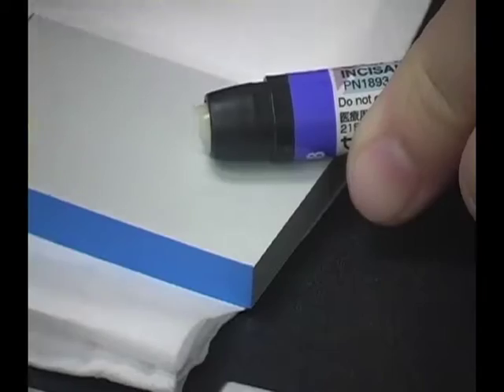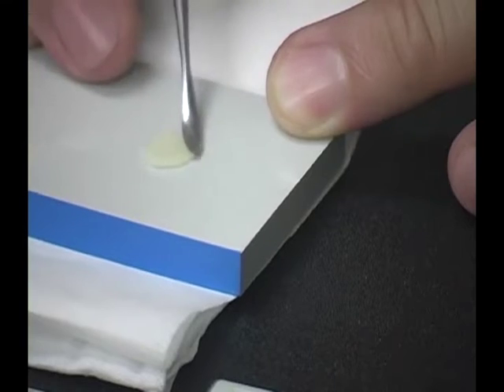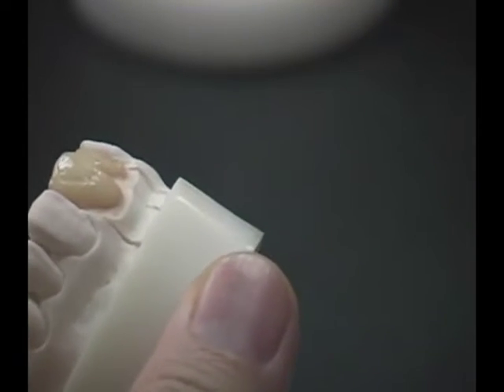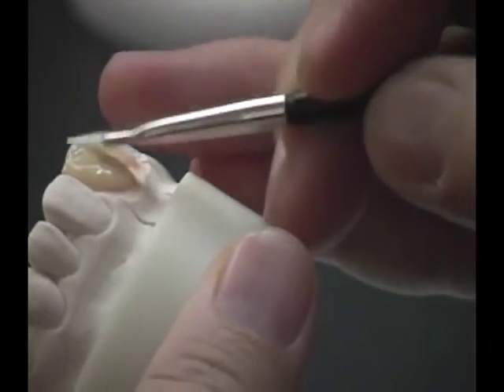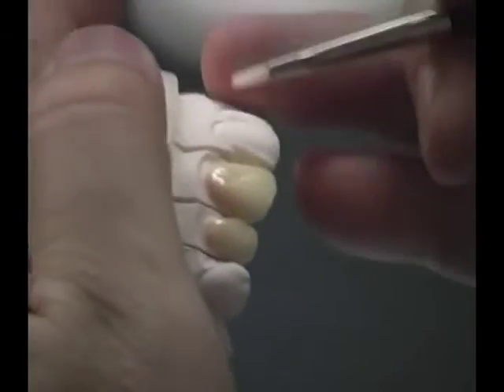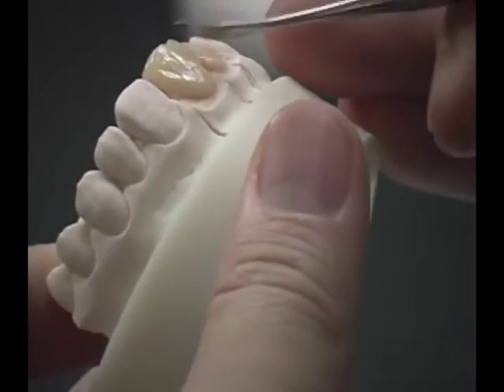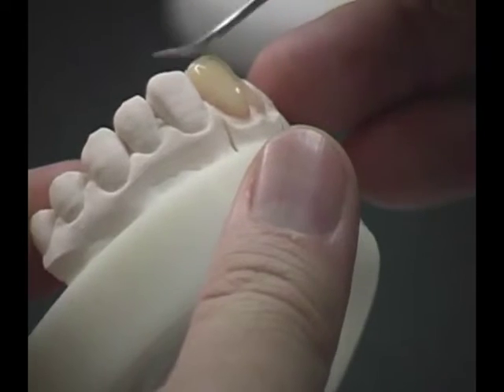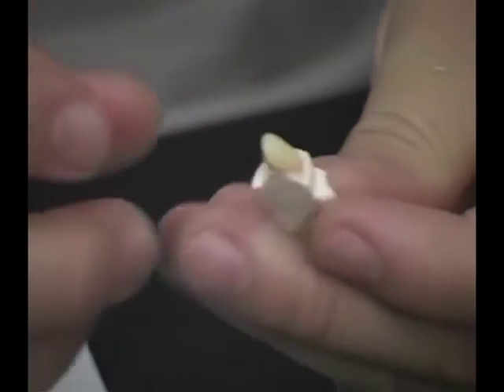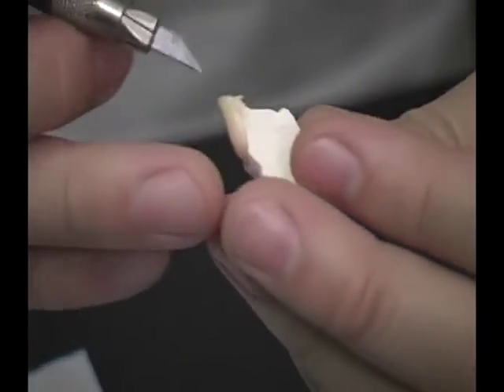Select the incisal shade and dispense the required amount onto the paper pad. Spatulate and take the desired amount to build up the incisal area. Use a brush to smoothen the surface and ensure that there are no air bubbles incorporated. Add ceramic incisal incrementally until the final form is achieved and smoothen with a brush. Remove the excess material from the interproximal area and check the final form of the veneer.